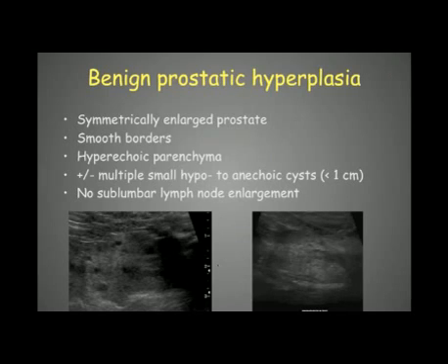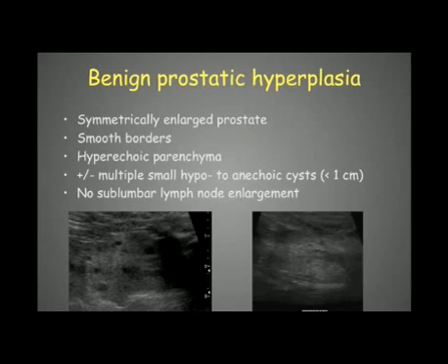When examining the prostate we also have to check the sublumbar lymph nodes, as this helps differentiate between different prostatic problems. In case of benign prostatic hyperplasia the lymph nodes should show no abnormality — they should not be enlarged or hypoechoic, and should appear normal or not visible.